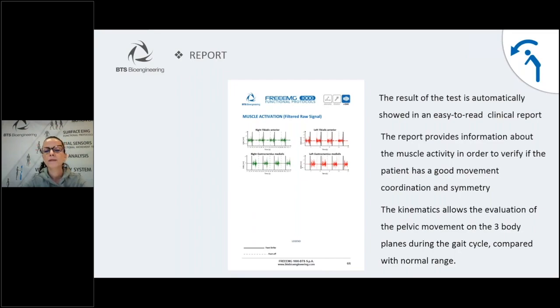We now begin a more in-depth reading of all the contents of the report.